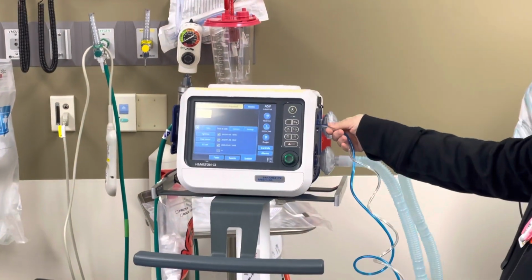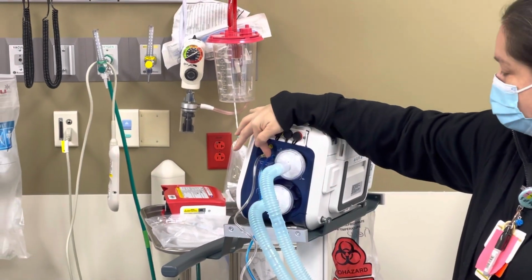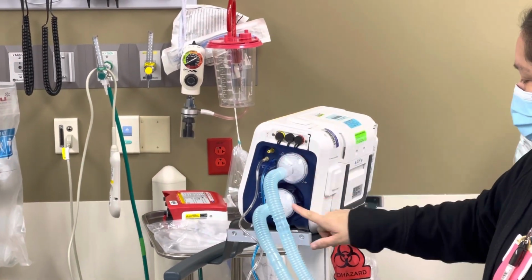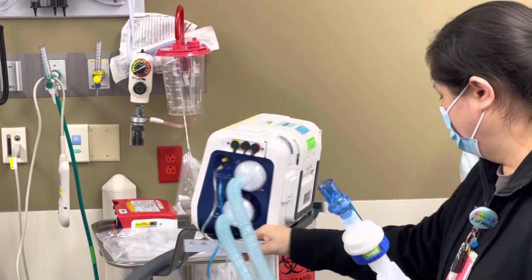Just make sure you got your flow sensor hooked up correctly. So it's color coded, so you have clear and you have blue. We always make sure that we have a bacterial filter here, and then we connect our vent. Your flow sensor will go here.